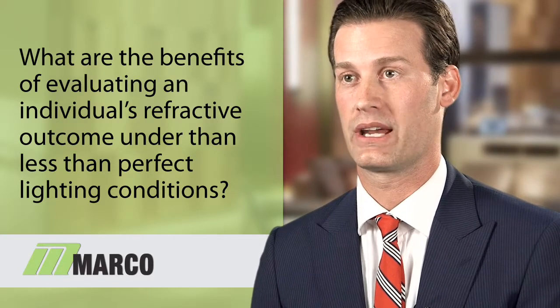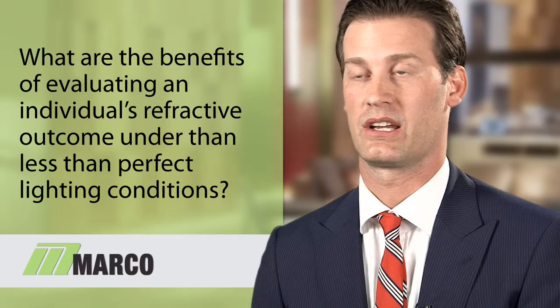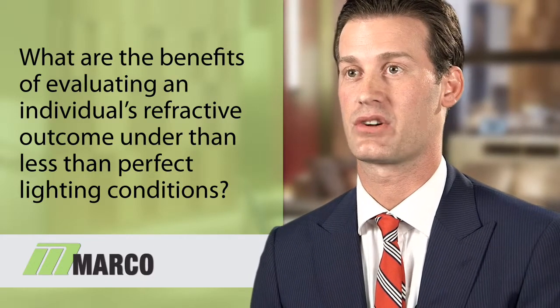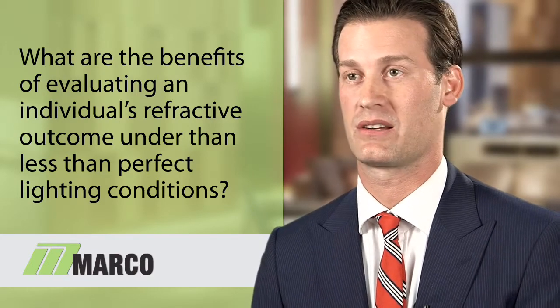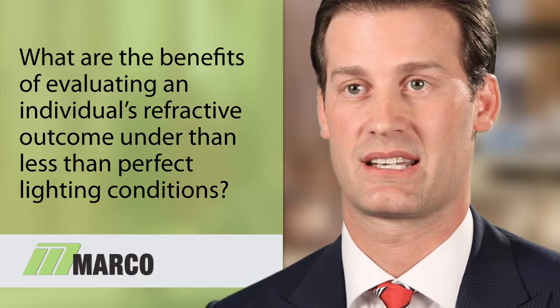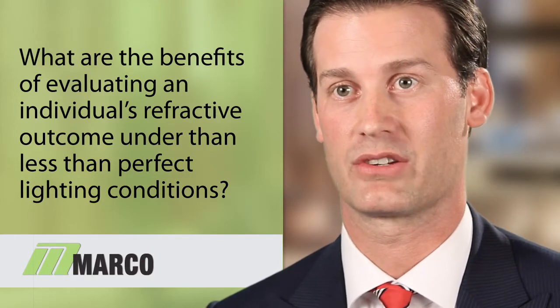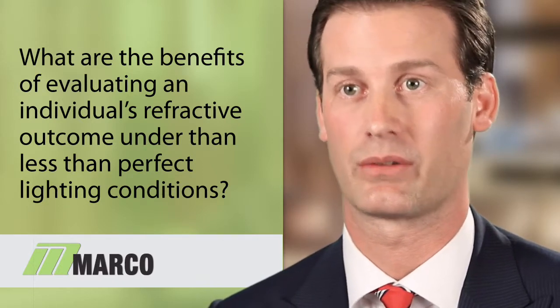And it's a wonderful way to illustrate what can happen when an intraocular lens of the toric variety is off axis. And more importantly, as I said, a picture can be worth 1,000 words. Demonstrating it to a patient really sets them at ease when you're able to sit down and show a patient exactly what it is that has led to their less than stellar outcome.